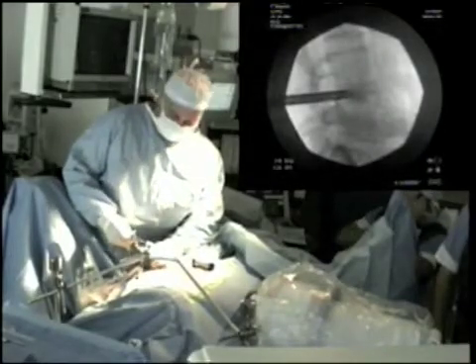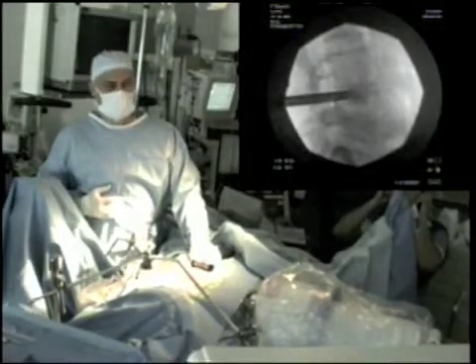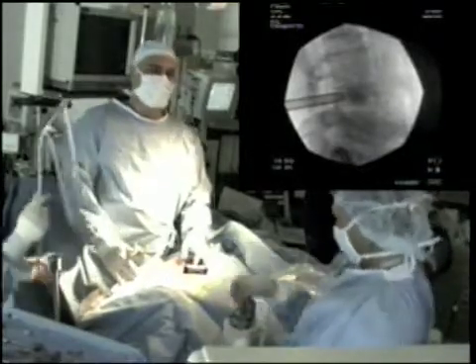As can be seen on the fluoroscopic view, bone is beginning to collect within the intervertebral space, leading to a distraction and increase of vertebral height.